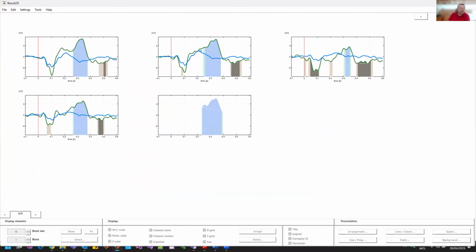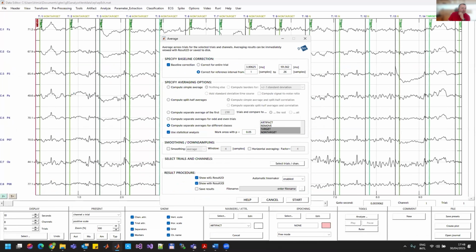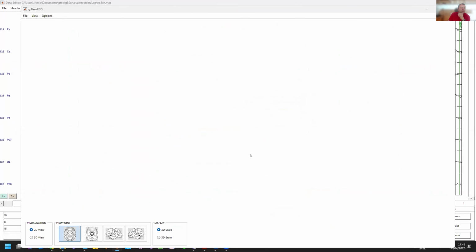But yeah, basically this is the P300 peak. It's almost P350, honestly. But yeah, it's not a problem. I'm getting older and that's why probably the delay is a bit higher. And I will do it again also with the 3D brain, with the 3D tool. One moment, it starts.